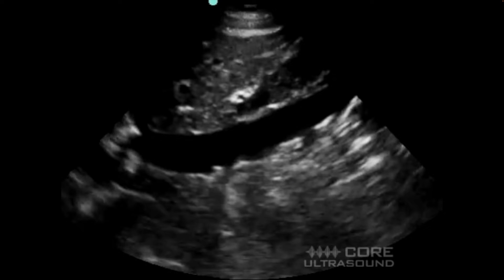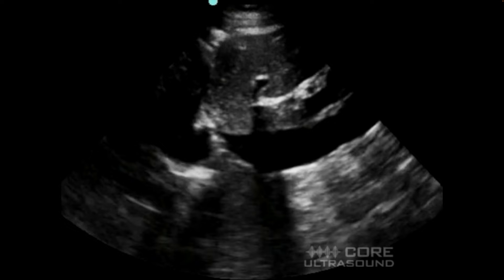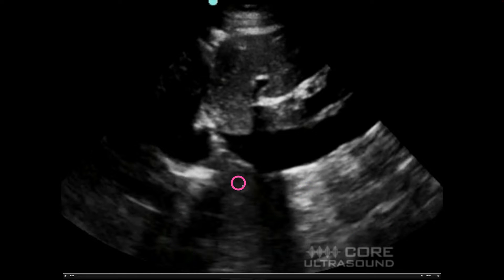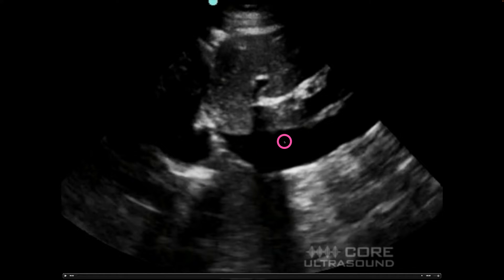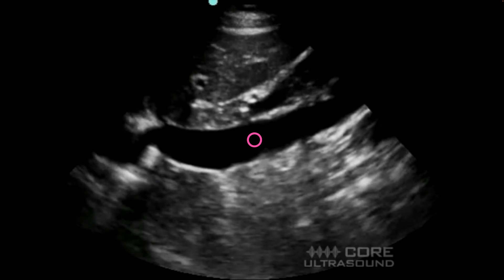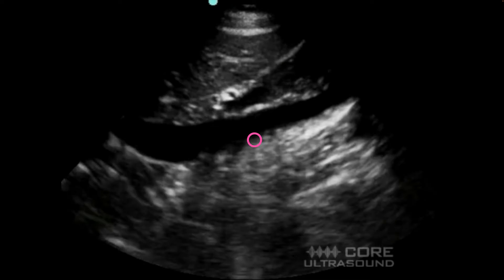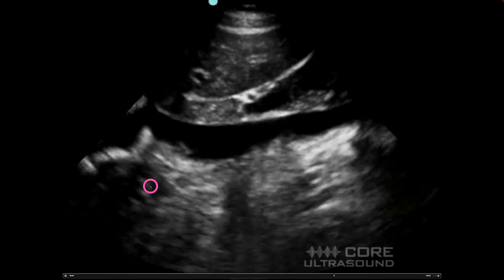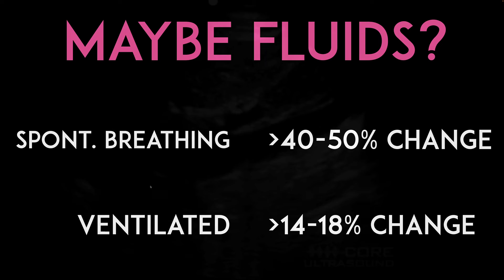Here is an IVC in the long axis. You can see the image moves from left to right — that's the patient breathing and lowering their diaphragm towards the feet. Once you get the view at maximum inspiration, calculate where two centimeters is from the right atrial junction using your calipers and measure the diameter there, then do the same thing on maximum expiration. You're looking for the change between inspiration and expiration.